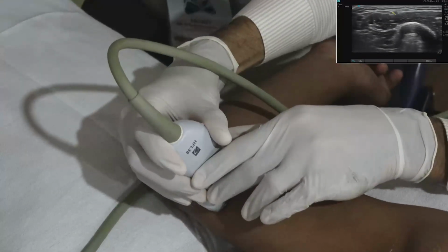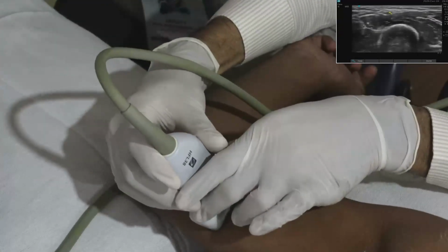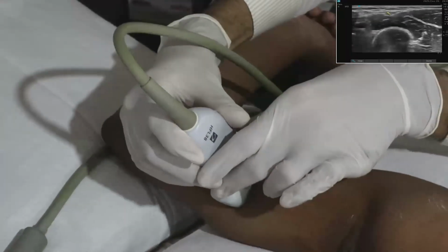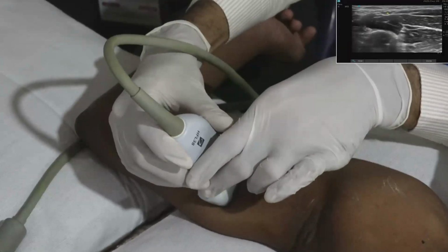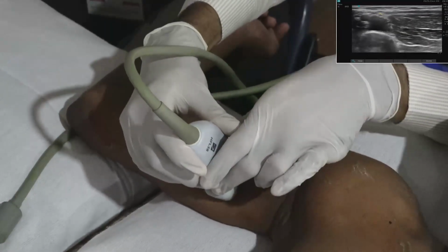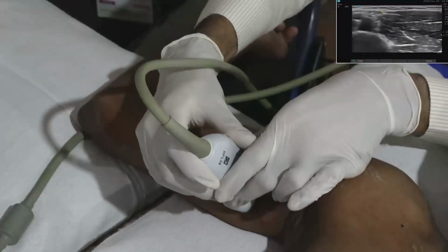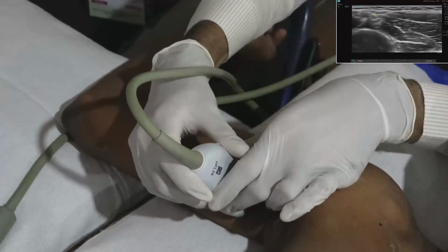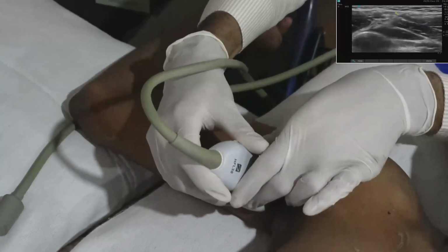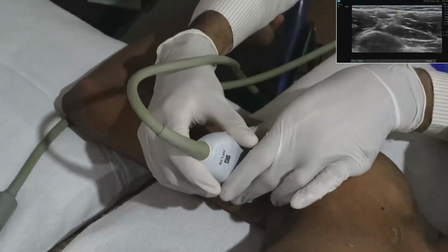Just below the skin and brachial fascia, this honeycomb appearance, that is the ulnar nerve. I am moving the probe towards the axillary area. We just have to follow the ulnar nerve. Now it is coming near the 2 o'clock position. Again I will trace it back.